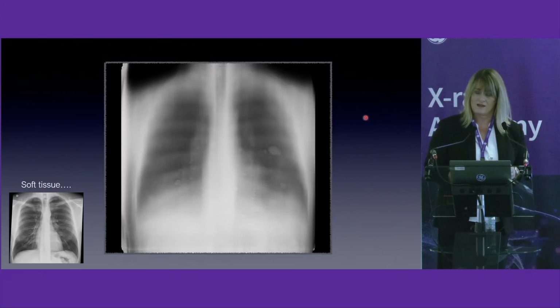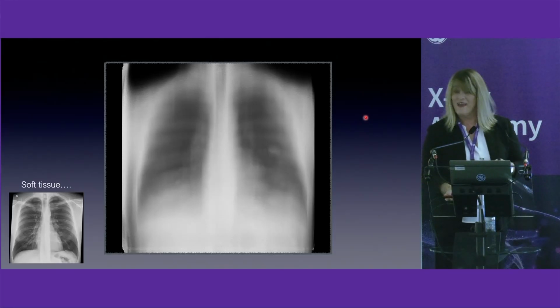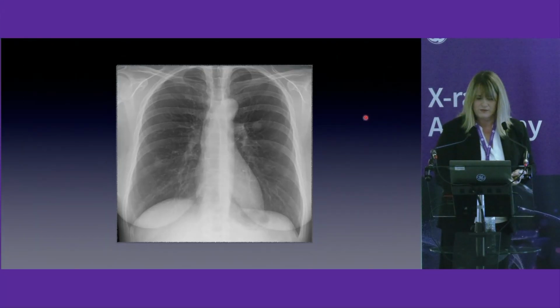Yes, for the X-ray of the chest and for the mammography as well, I need to know what she or he has on the skin and draw it. It's fundamental. It's absolutely important in the interaction between the technical part and the medical report.